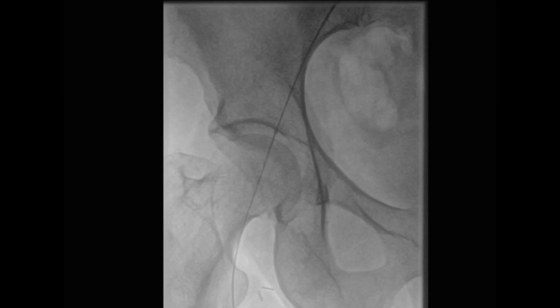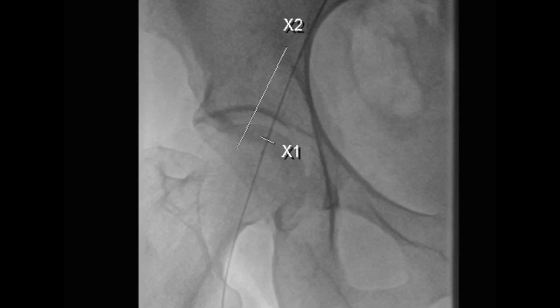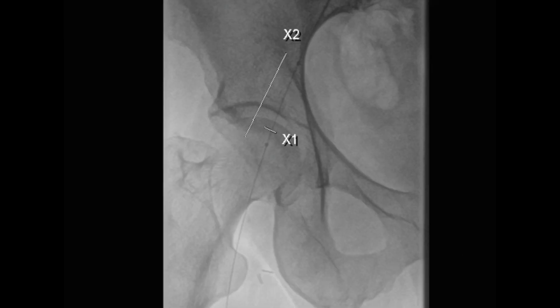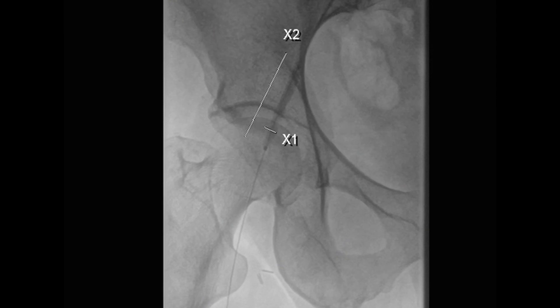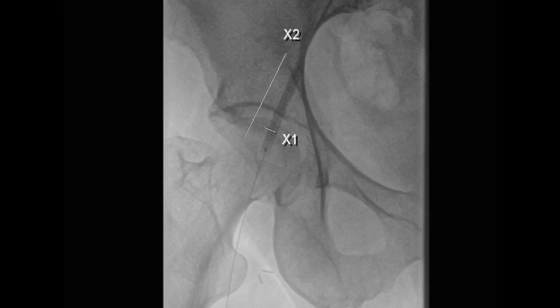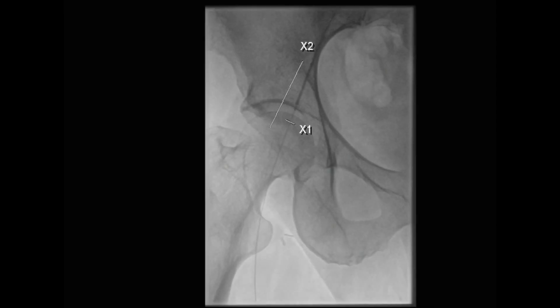This was followed by introduction of a 5 millimeter balloon to perform pre-dilatation of this high-grade stenosis in the external iliac artery. The balloon was inflated to nominal pressure and the right external iliac artery was then balloon angioplastied.